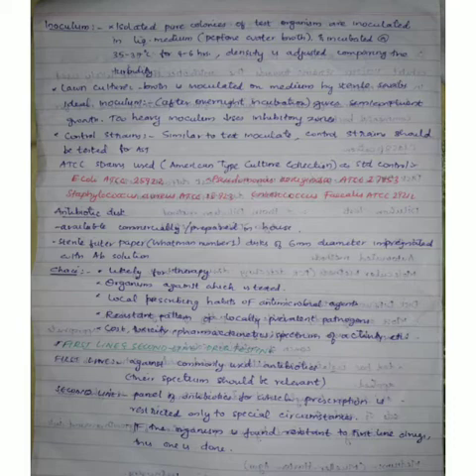Next is second line drugs, and it will include a panel of antibiotics for which prescription is restricted only to special circumstances. So we will test this only if the organism is found resistant to all the first line drugs. We have to test the second line drugs also.